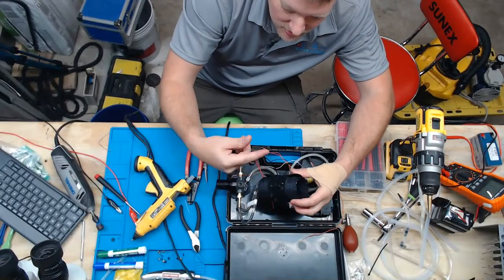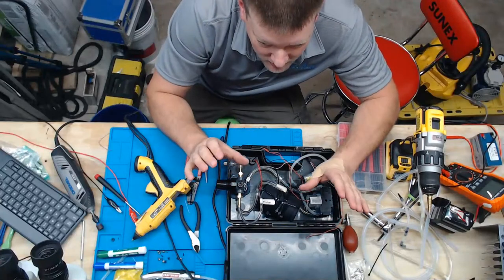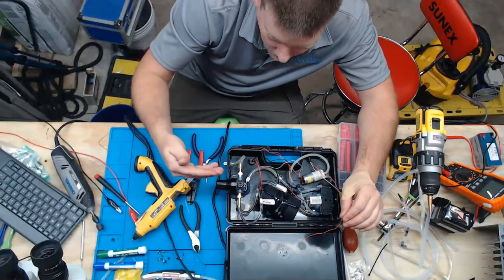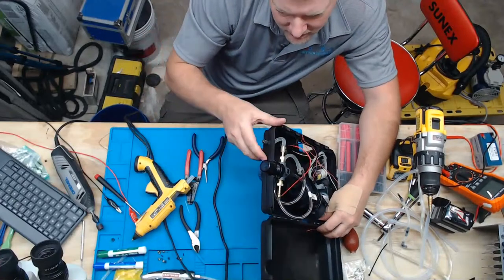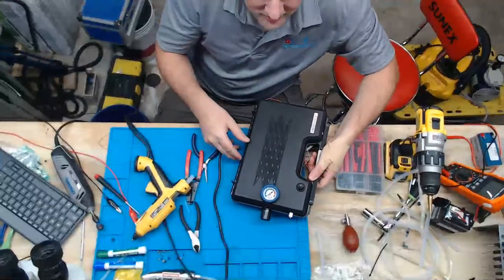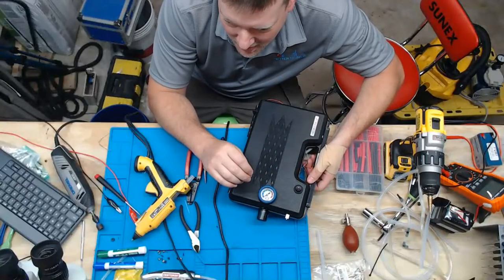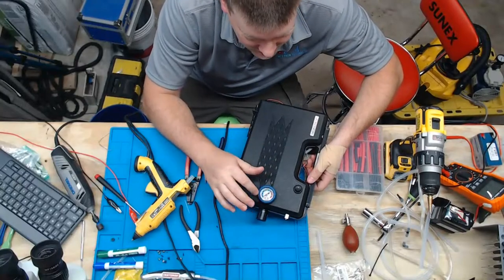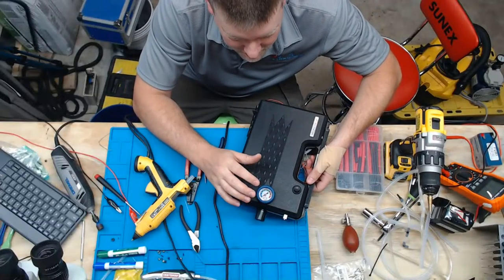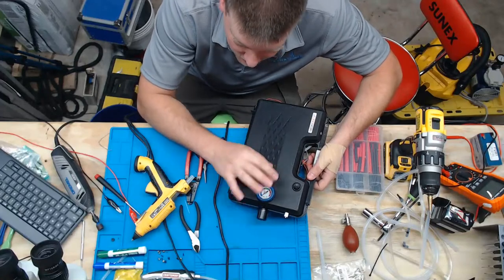this air reservoir. You might recognize it as a pneumatic tourniquet. It's rolled up. And you have to have an air reservoir to stabilize the air pressure because you don't want your air pressure going up and down. You want it to be stable before it hits your regulator. And you can see here in the side of the case, I've already put in a regulator, and you can see on the outside, I have the gauge. Believe it or not, these are all pieces to other devices. Like this gauge right here, I think it's from an air conditioning Freon booster, but it's still in PSI, and that's all I need to utilize this device.